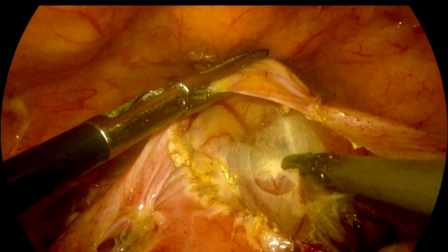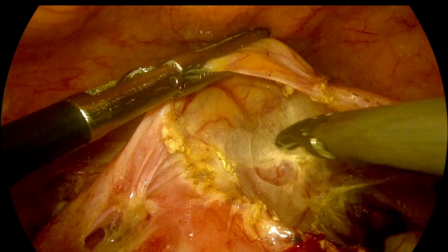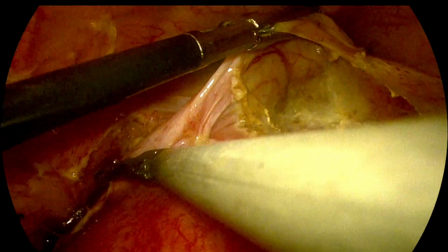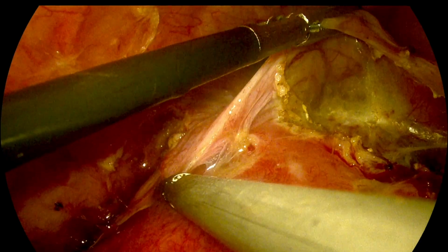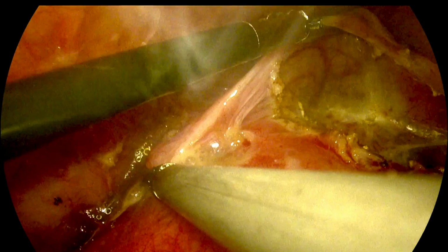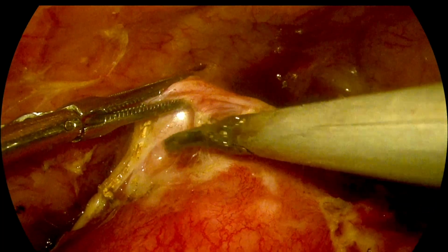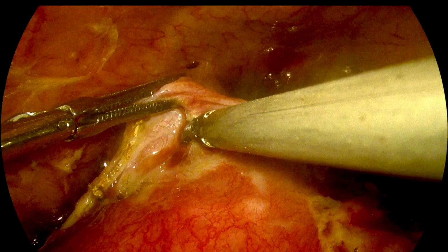So in the left hand I'm holding the uterovesical fold of peritoneum. Along with that, the bladder is also pulled up and it is being separated from the anterior surface of the cervix. And we're trying to divide it.